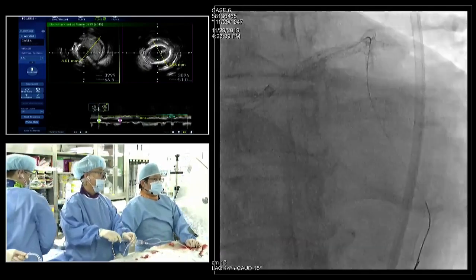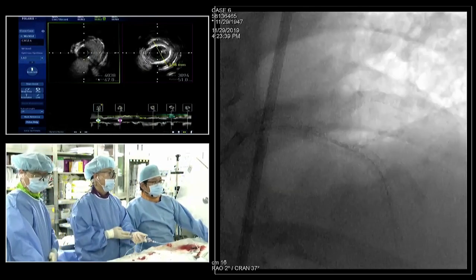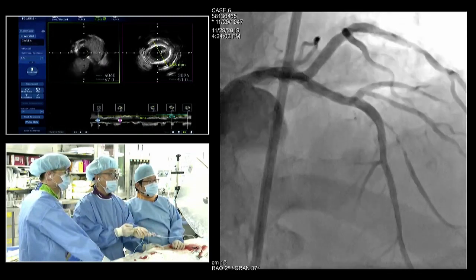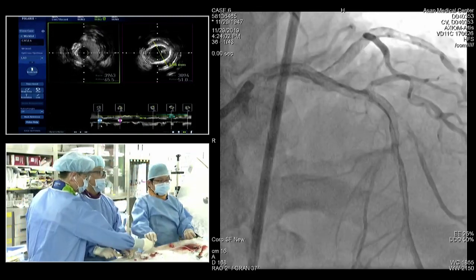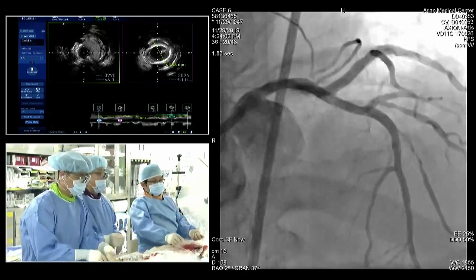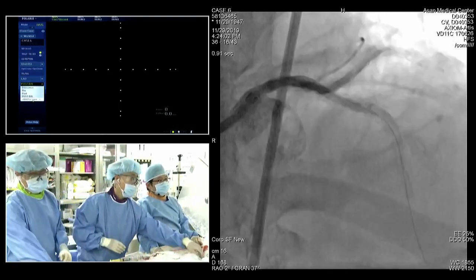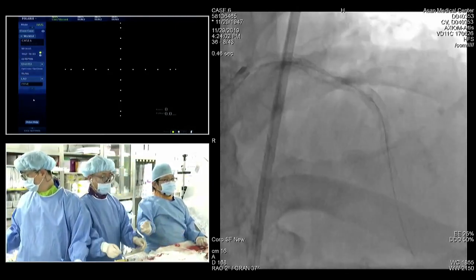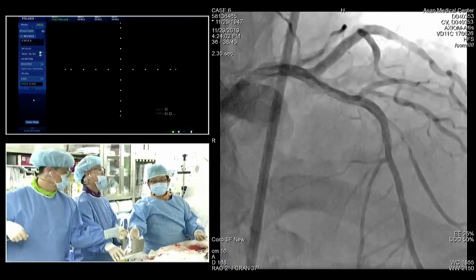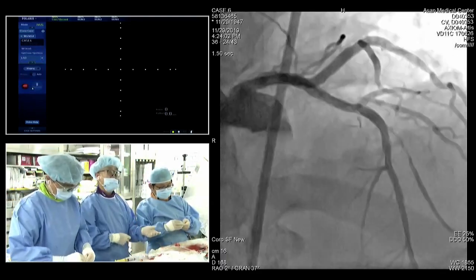Okay, let's just see what happened. Ready? Okay, deploy, ready. The 3.0 stent. Okay, good. Very good. 2.5, 3.0, 3.5. 2.5 high pressure balloon, please. 2.5, NC. Okay. So after, okay, we'll move another Calab and then we'll be back, right? In the last one. Okay, got it.